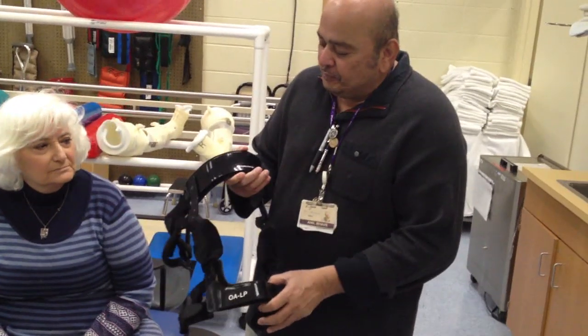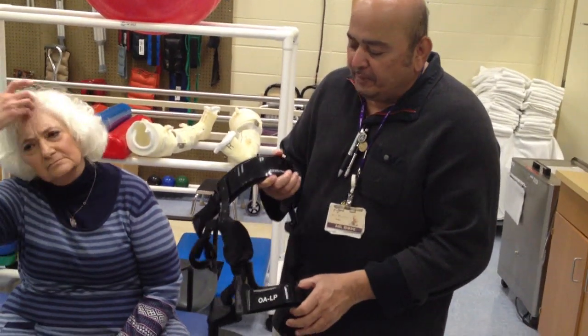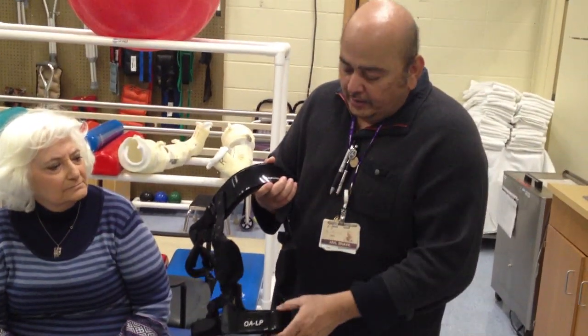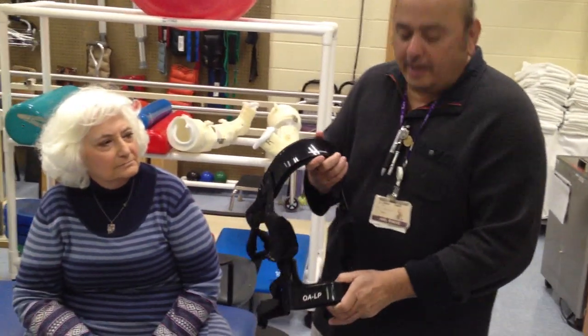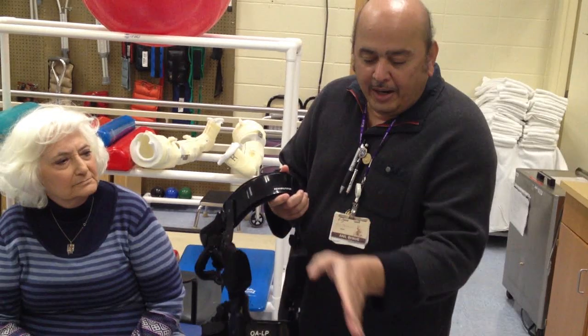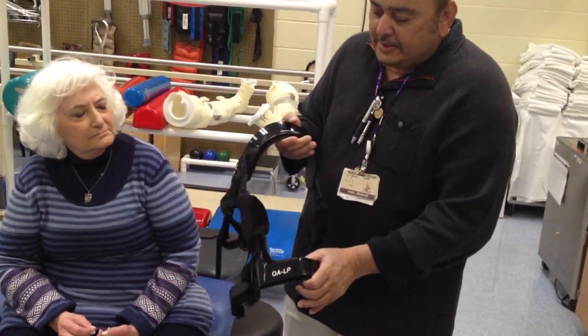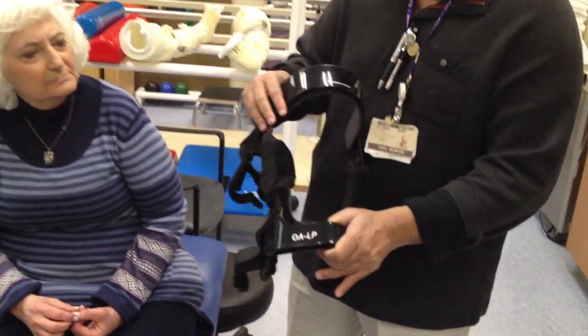We've been using and studying this brace. It's a pretty innovative idea of unloading the knee joint. Barbara here has arthritis of her knee and some mild deformation of her knee joint, and this brace has three or four great properties.